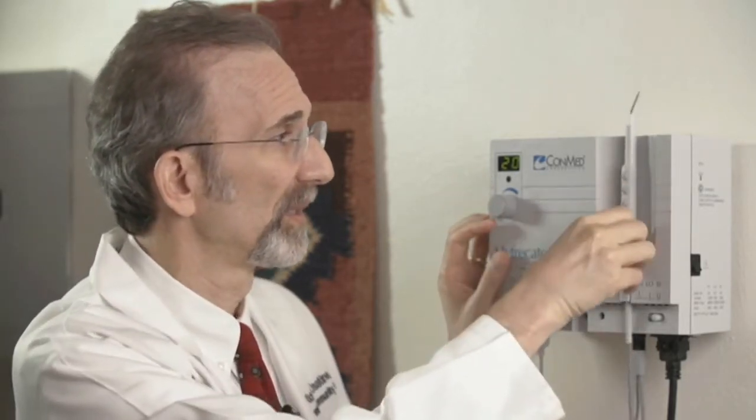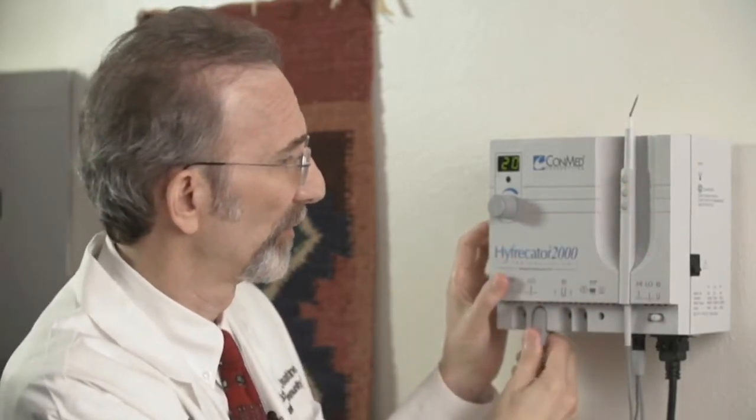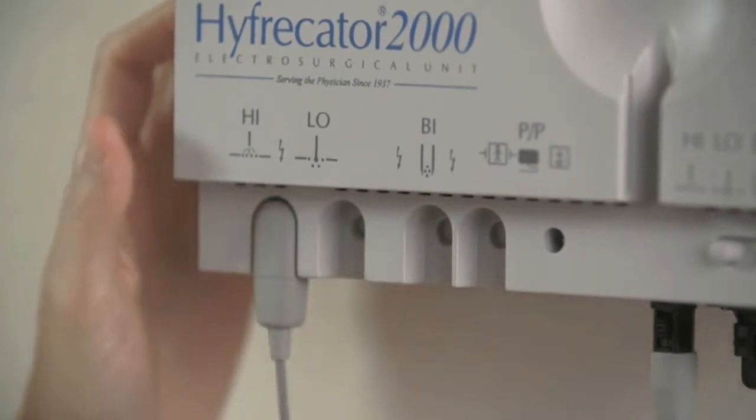Now, if I need more wattage than 20 on low, then what I do is I put the handpiece there, pull this device out of low, push this over to high, push this in, and now I have the ability to use wattage settings all the way up to 35.